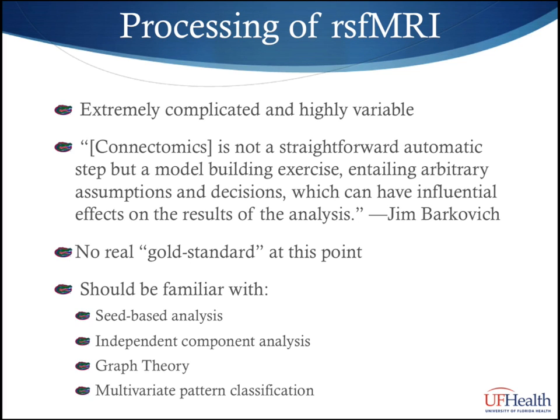A third method for processing is so-called graph theory analysis. This is an interesting model because it integrates multiple data sets such as functional MRI, DTI, EEG, structural data, etc. into one unified connectivity model. I'll talk more about this in just a second.